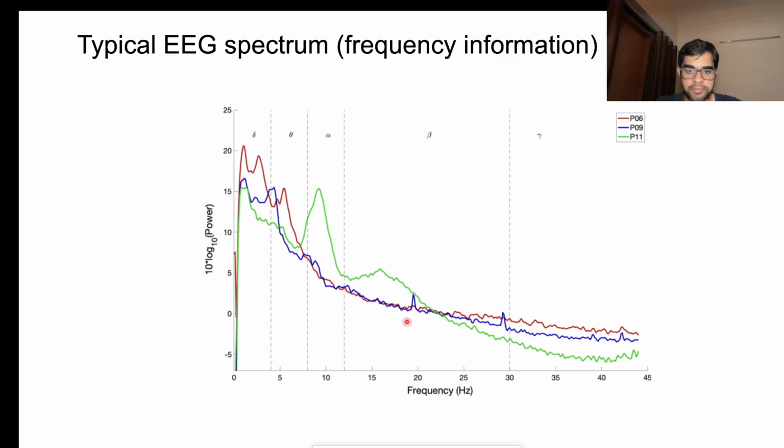Is it not that the brain activity is in the low frequency range, and in this particular graph, higher frequency components are less? Is it not like that? Yes, exactly. It is just because of that. The number of components contributing to this is actually the opposite way, but we can discuss that in the next class. It's like the more numbers you average, the average value reduces, kind of thing.